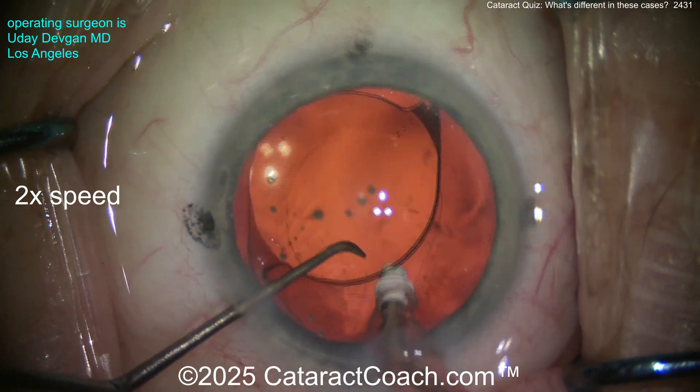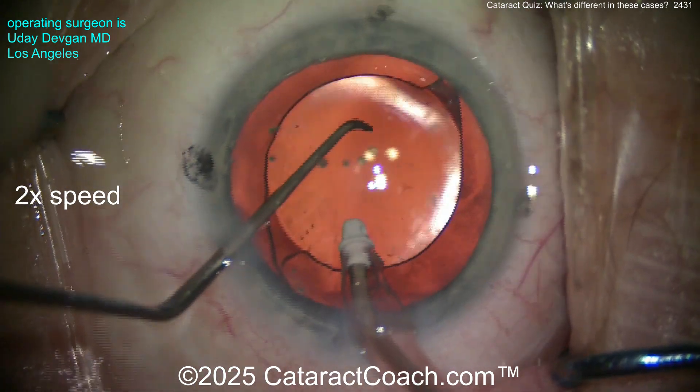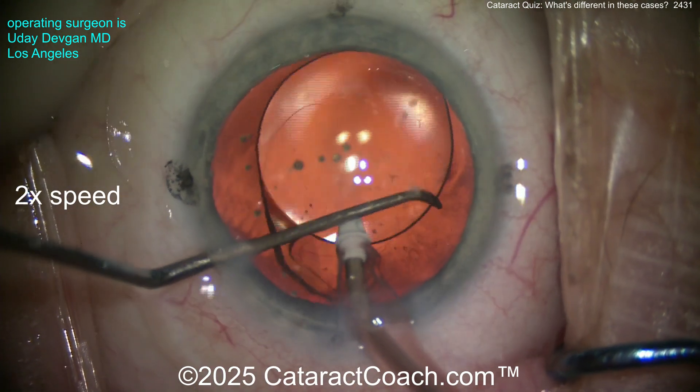It looks like there's a little bit more lens cortex back there — really want to clean all that up, don't want to leave it around. Now get this toric lens set, and you can see we can rotate it even backwards — rotate it whatever it takes.